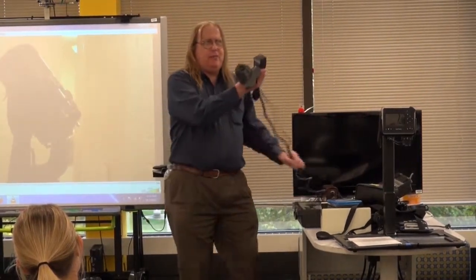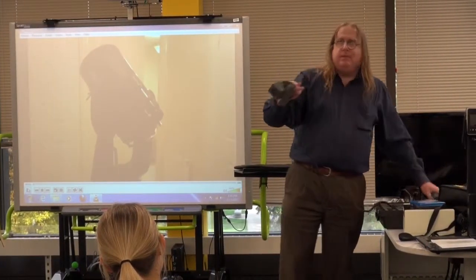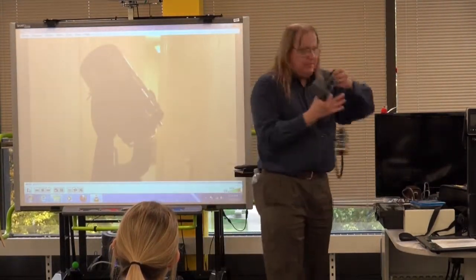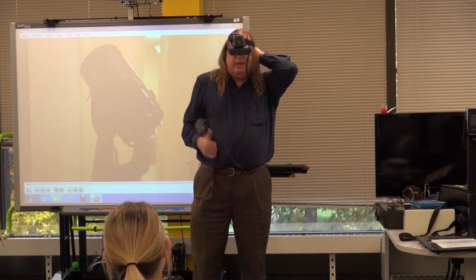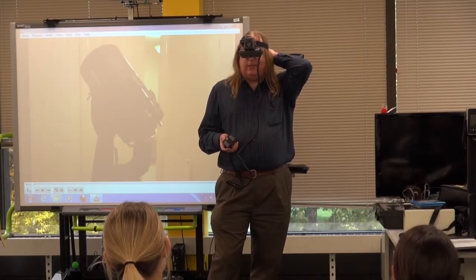Remember how I said if I can find something that has been made for sighted people and figure out how to use it? Well, you've all seen a digital camera with a zoom lens, right? You all know what a TV is, right? Why not combine a camera with a zoom lens with a little TV that you can wear? Like this, it goes over the head, and you turn it on, and this is essentially like looking through a camera and zooming in on something.